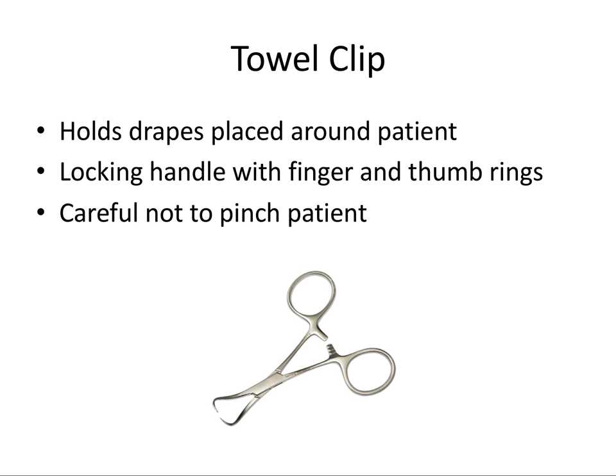Next we have the towel clip. If you place towel drapes around the patient's head for sterility, you can use these towel clips to hold the drapes in place. It has a locking handle with finger and thumb rings and you have to be careful not to pinch the patient's skin. You can even use the rings to stabilize suction tubes, but again just be careful not to pinch the patient's skin.